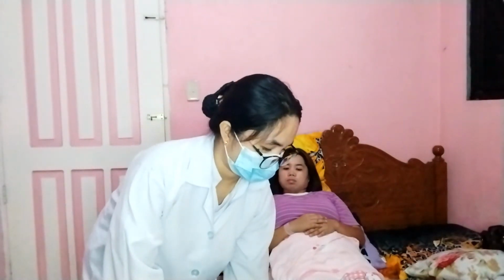Number twelve, encourage the patient to perform incentive spirometry 5 to 10 times every 1 to 2 hours if possible. Number thirteen, clean the mouthpiece with water and let it dry.